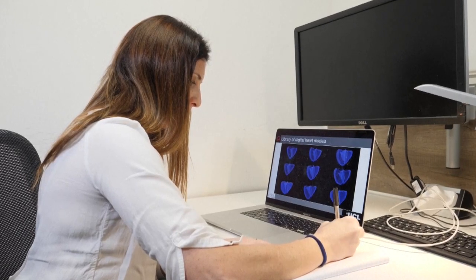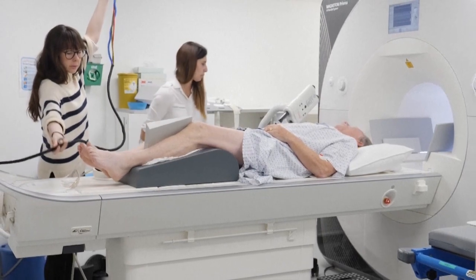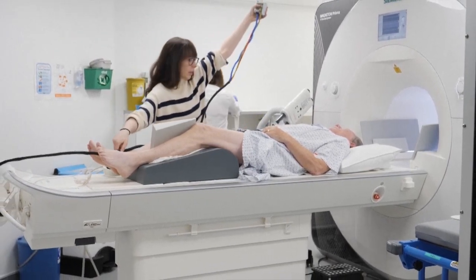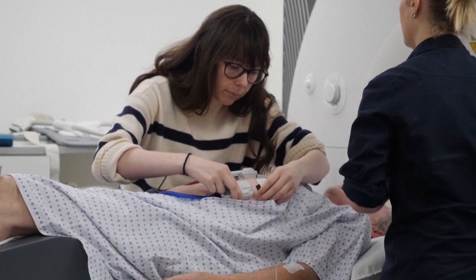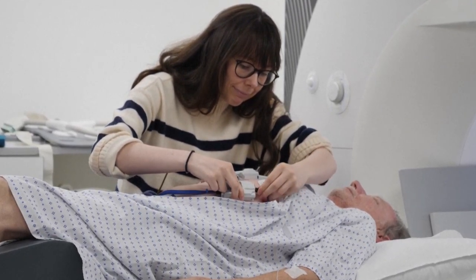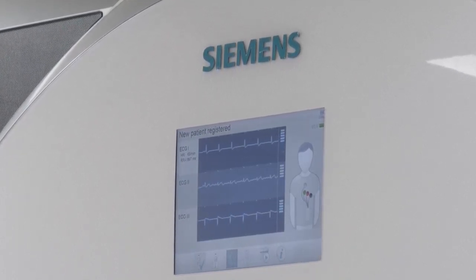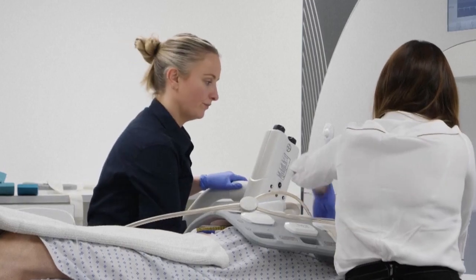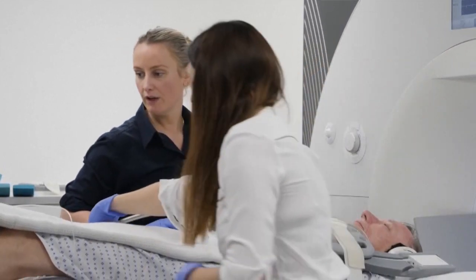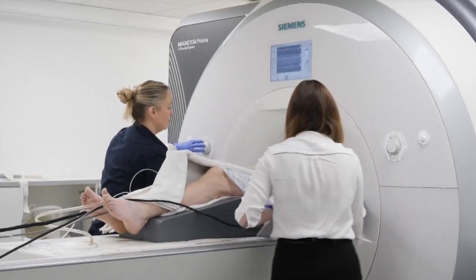That's a doctor out of the University College London Institute of Cardiovascular Science and Royal Free Hospital in the United Kingdom of Great Britain and Northern Ireland, explaining that while modern medicine has some great tools for taking a look at a heart's condition, they haven't always assembled a full picture. But the missing bit of the jigsaw has always been the electrics of the heart. So up until now, there was no convenient and easy way of integrating the electrics of the heart on top of all this amazing data that's coming out of the cardiac MRI scanner.